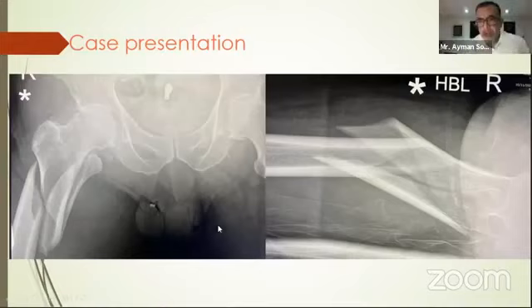In my opinion, I think all of you are definitely right. The comminution with the large fragments. I would advise you always to keep an eye on the deformity. The deformity is what will trick you. The deformity is what's going to make your surgery become difficult. Look at the amount of flexion we have on the proximal fragment. This is a massive amount of flexion.